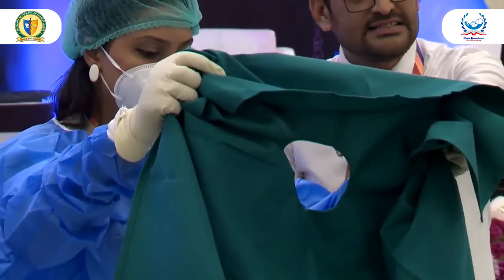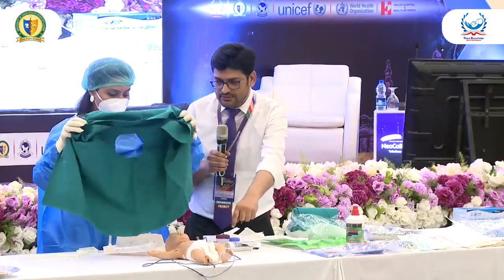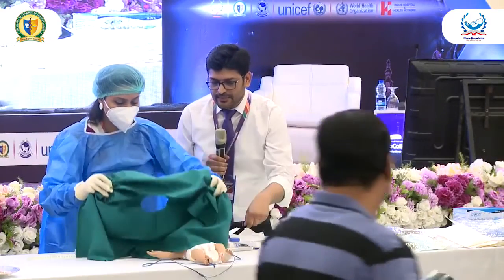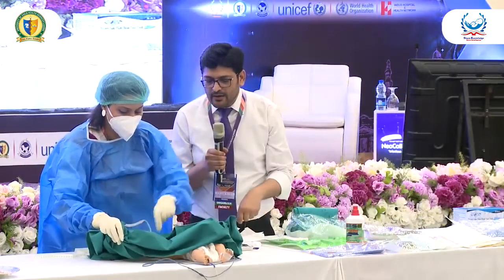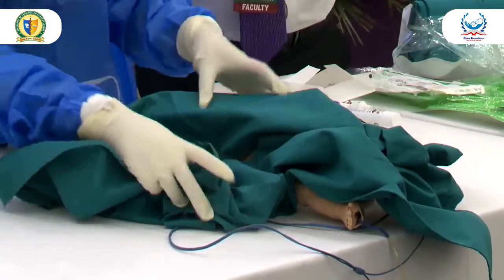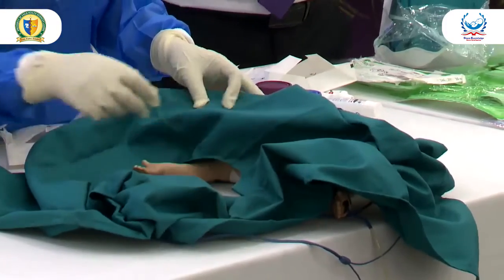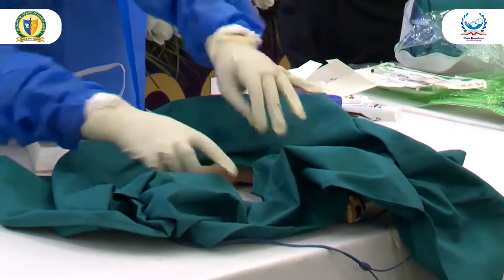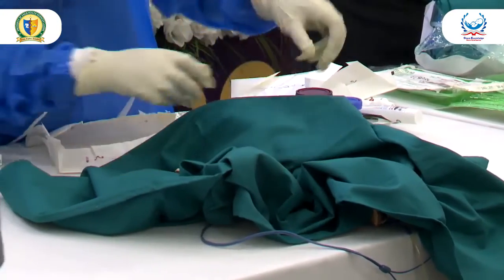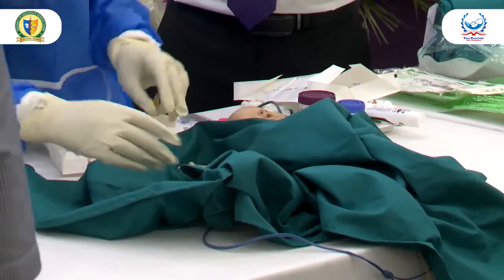There is a central hole, an aperture, in it, and we are about to place that sheet in a way that the face of the baby must be exposed to you, so that you may notice any color change or breathing of the baby.